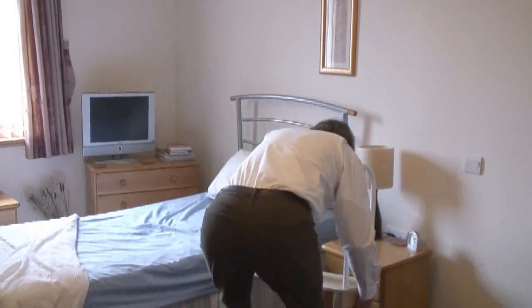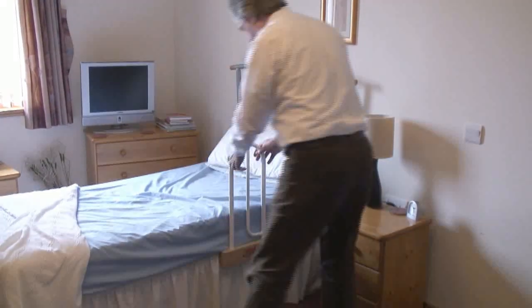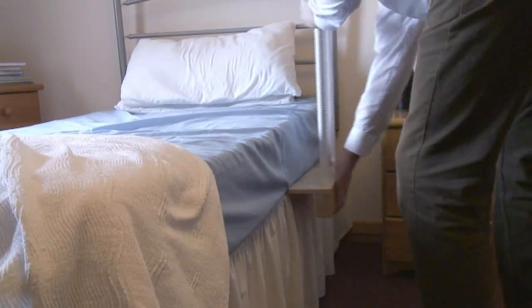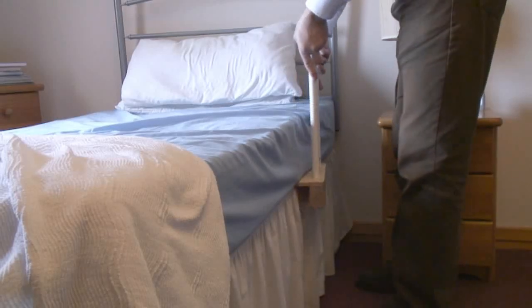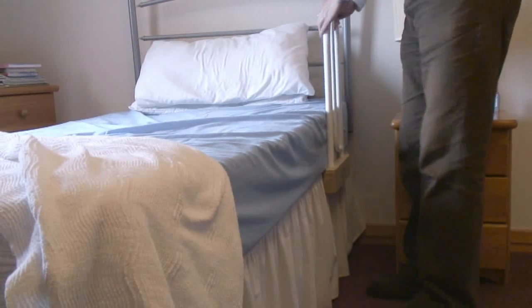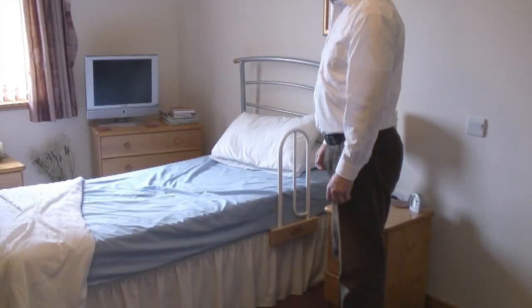What I want you to do, Charles, is it just slots simply between the base of the bed and the mattress. It can be adjusted up and down the bed, and sometimes you might want to play about with it just to get the optimum position for you. If you find that it is moving around, there are strap kits available which fit quite easily to help hold it onto the bed. But for most people, it's quite adequate as it is.